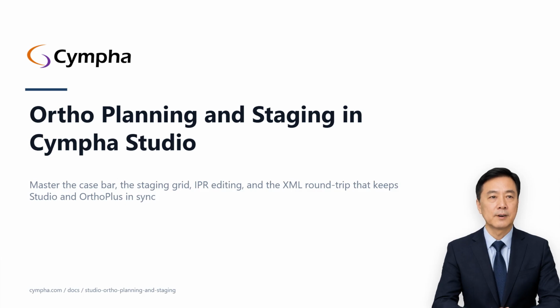This is the deepest of the Studio lectures, 15 to 20 minutes for your first case, 5 to 10 per case after that. Follow along on screen, or listen now and read the written guide later. Let's get into it. Here's the arc of this lecture.